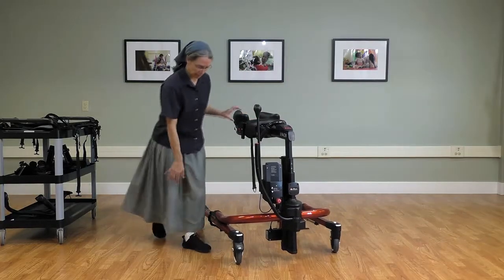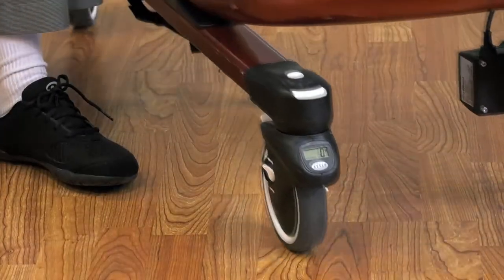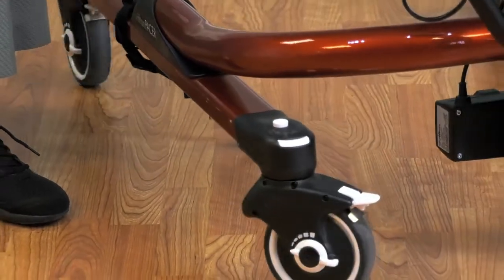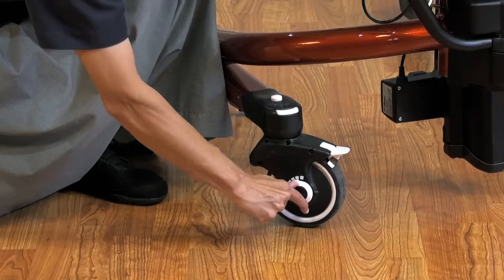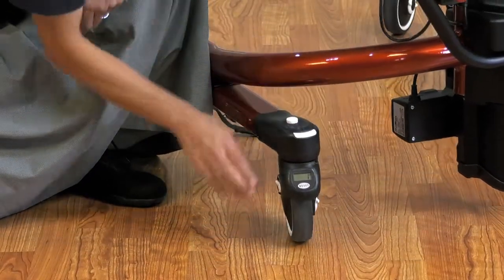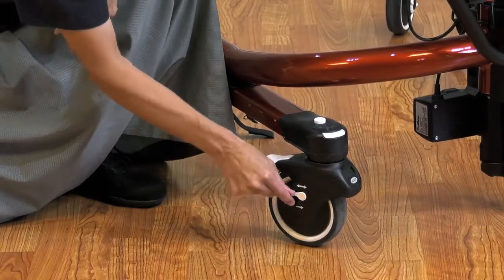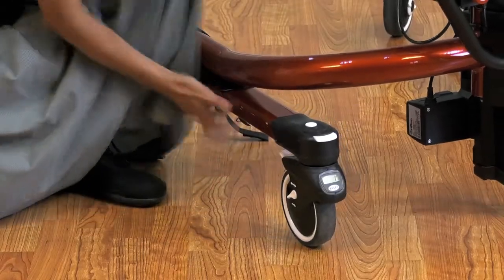Other features of the caster that are very important for gait training include a foot-activated swivel lock, which can be released by tapping the front. We also have the drag, which is a white-on-black marking — increasing the resistance as you turn that. And then we have the forward-only direction lock, which is used in combination with the swivel lock.